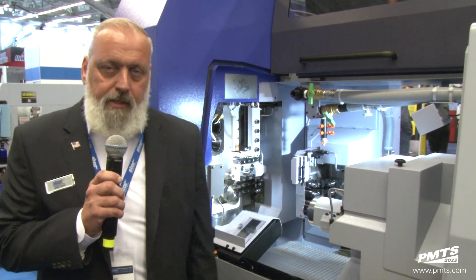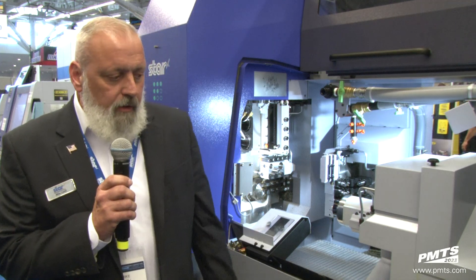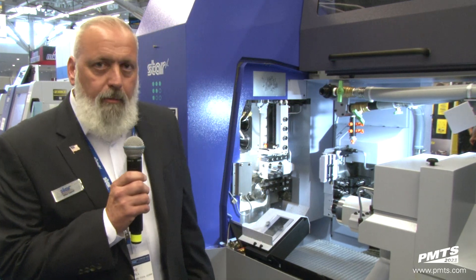I'm going to show you our brand new model, the SD26 Type S. This is a true one-inch Swiss machine. We have several different varieties of Swiss machines — 20 millimeter, 38 millimeter. This particular model was designed mainly for the orthopedic industry, trying to keep up with the demands of the latest designs of all the medical screws.